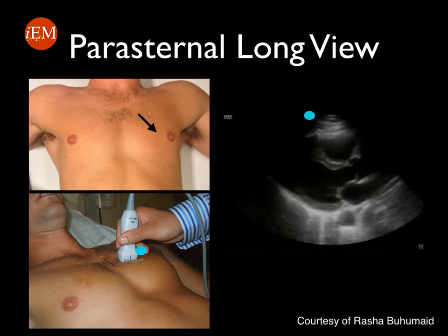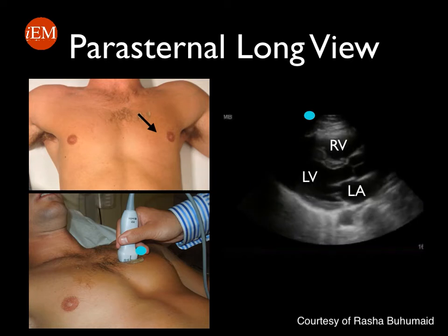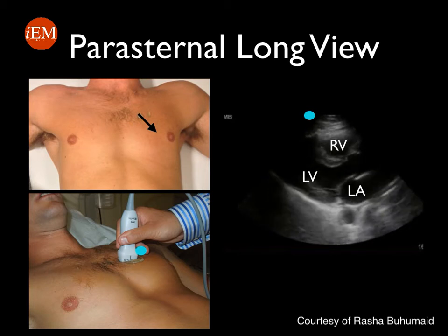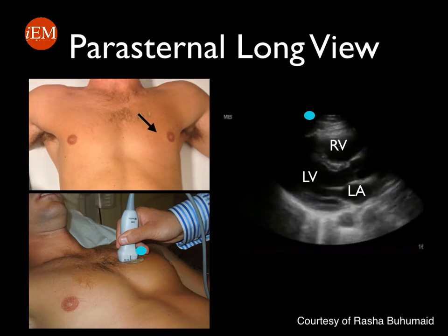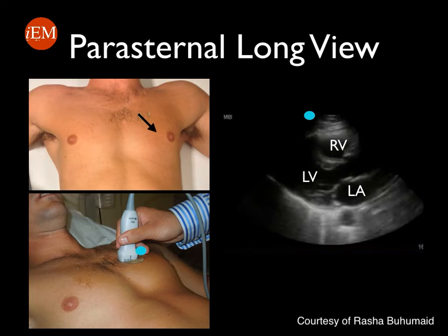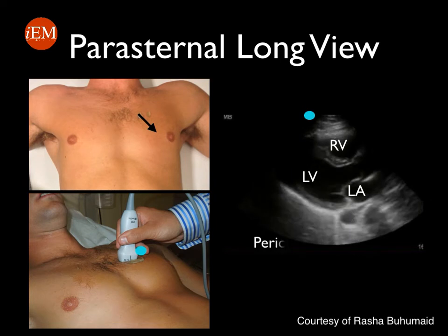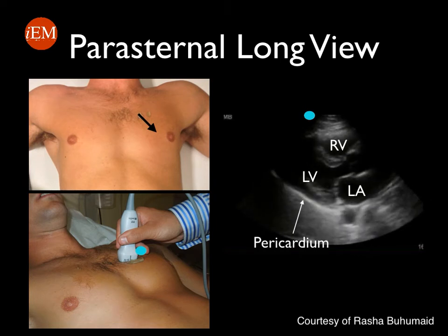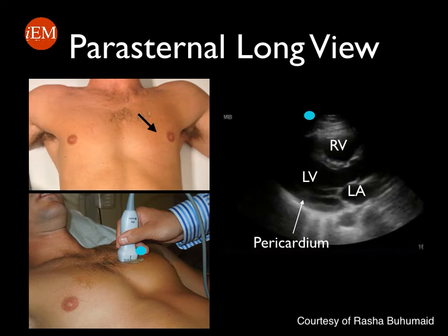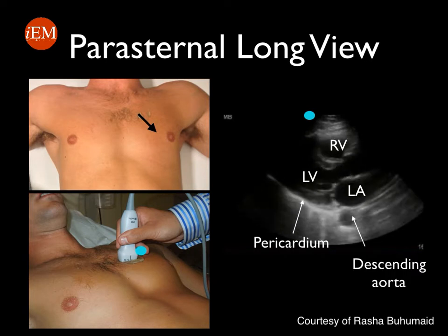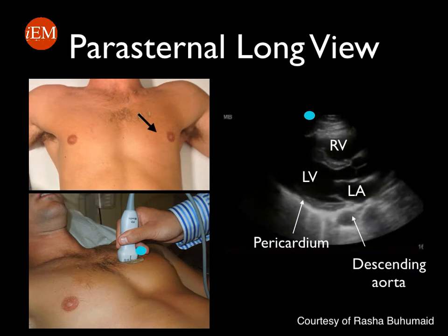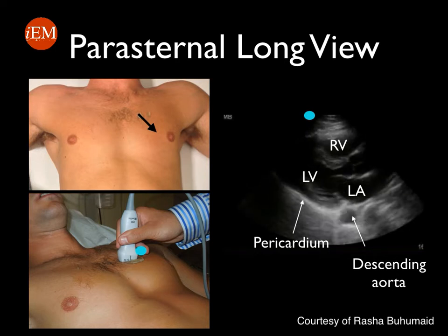Note that the first chamber close to the ultrasound probe is the right ventricle, then there is the interventricular septum, the left ventricle, and the left atrium. The valve between the left ventricle and left atrium is the mitral valve. The white bright stripe surrounding the heart is the pericardium, and there is a circle corresponding to the descending aorta. These are very important landmarks you should be able to identify in a normal parasternal long view.